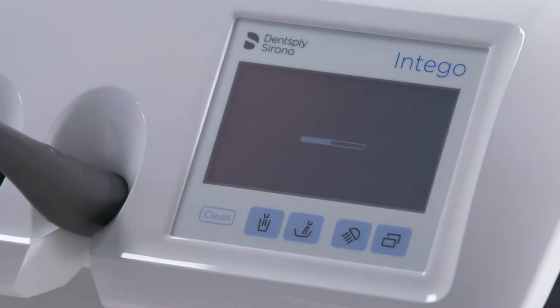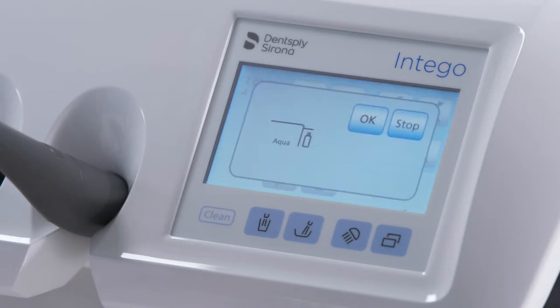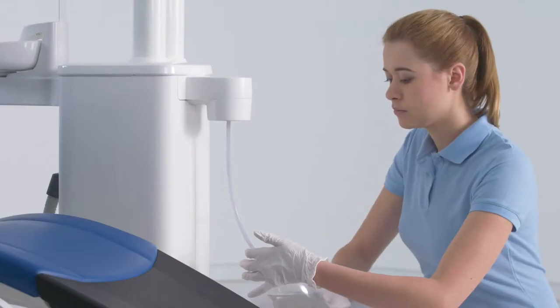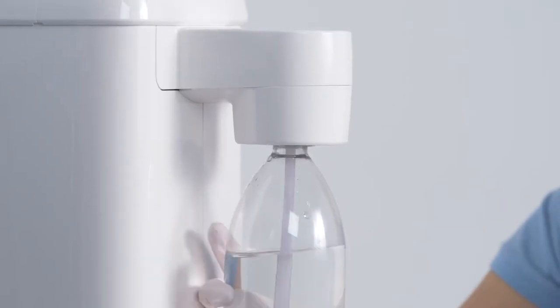When your treatment center is switched on, 'Fill water' will appear on the EasyTouch display. Fill the fresh water bottle with a mixture of water and Dentosept S at a ratio of 100 to 1.